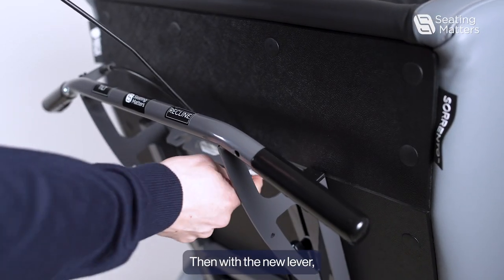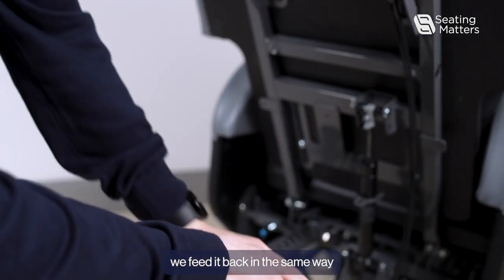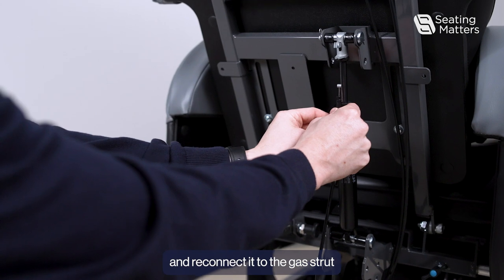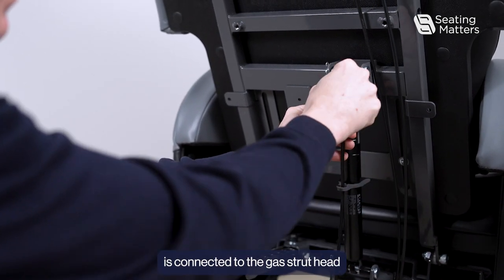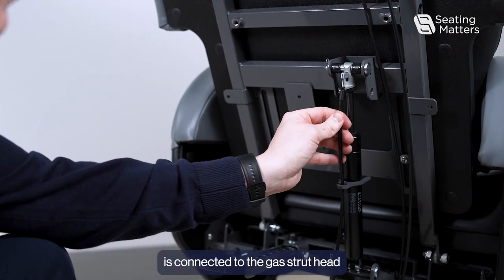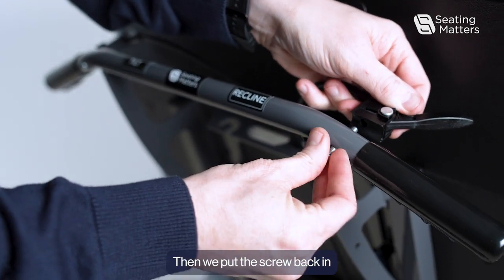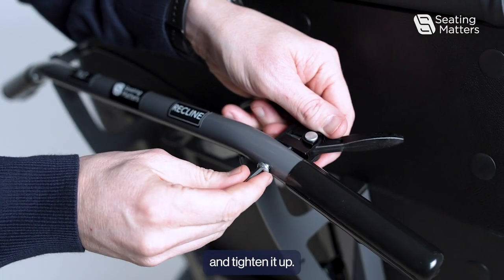Then with the new lever we feed it back in the same way and reconnect it to the gas strut by making sure the barrel at the end of the cable is connected to the gas strut head and clipped in. Then we put the screw back in and tighten it up.